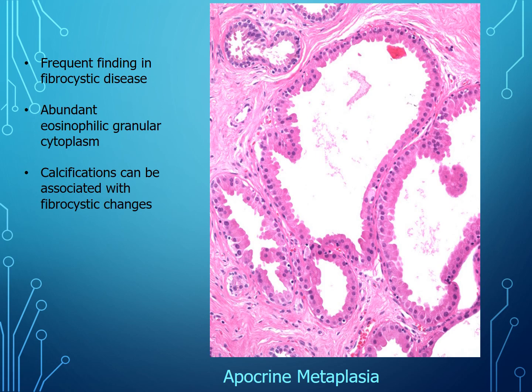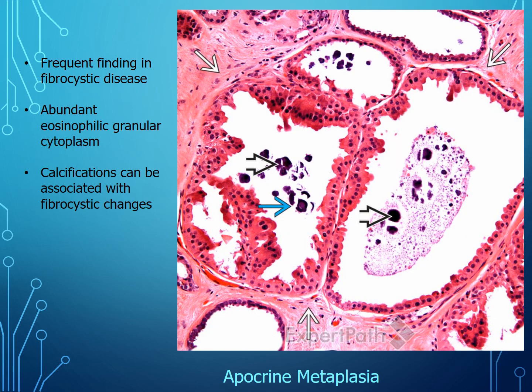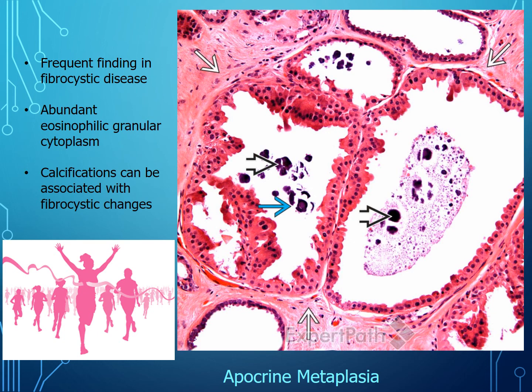Apocrine metaplasia is a personal favorite type of fibrocystic change — it's really pink and pretty. Cells lining these dilated ducts still have myoepithelial cells and luminal cells, but notice the beautiful abundant granular eosinophilic cytoplasm, which gives it its pink look. Sometimes this is associated with microcalcifications. Remember, microcalcifications are normally associated with ductal carcinoma in situ, but they can also occur with benign fibrocystic change.